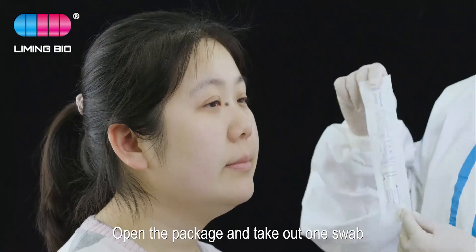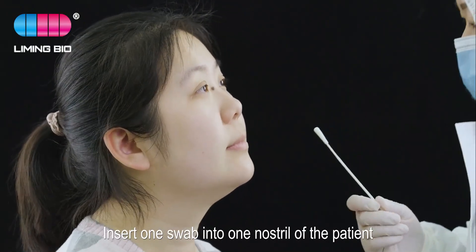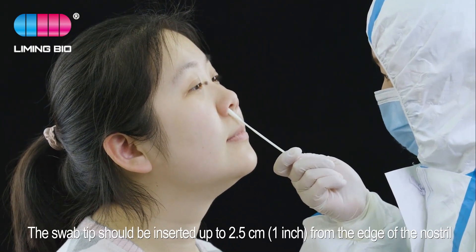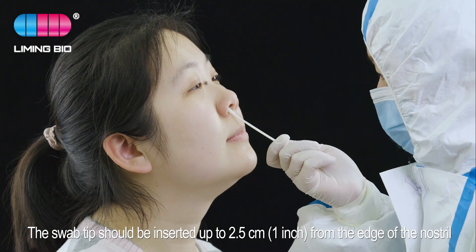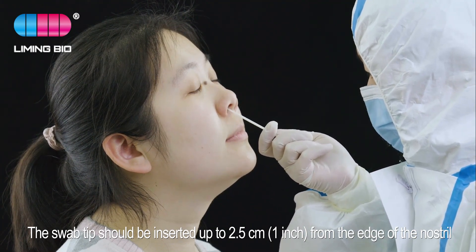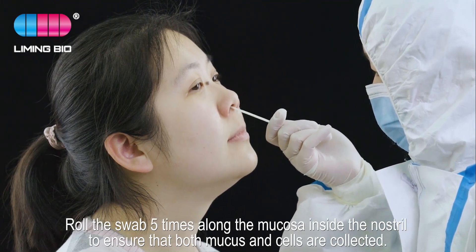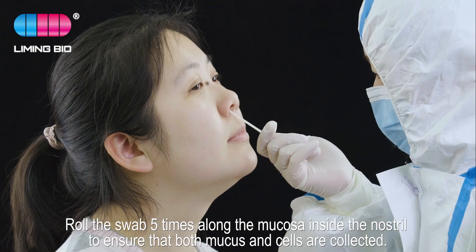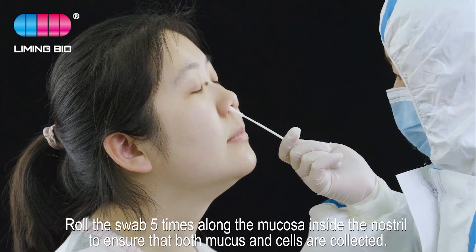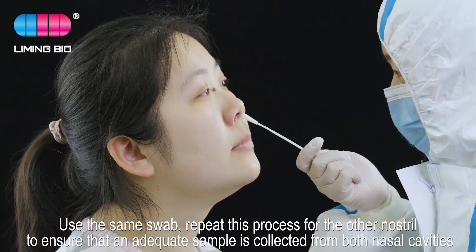Open the package and take out one swab. Insert one swab into one nostril of the patient. The swab tip should be inserted up to 2.5 centimeters (one inch) from the edge of the nostril. Roll the swab five times along the mucosa inside the nostril to ensure that both mucus and cells are collected.